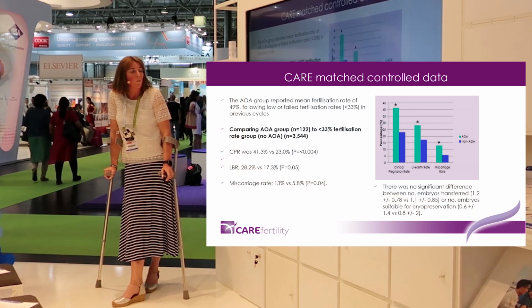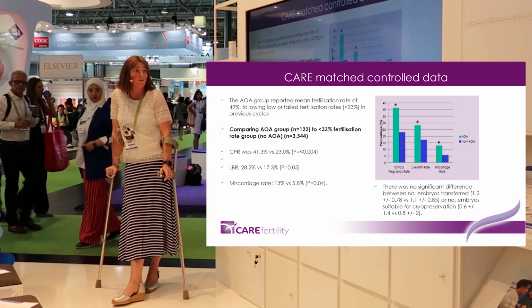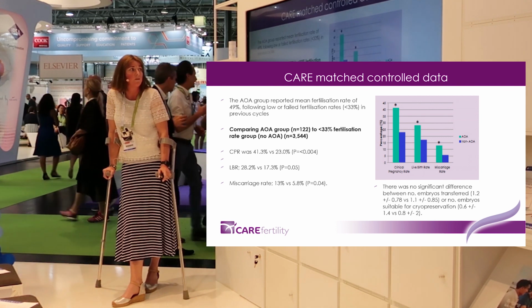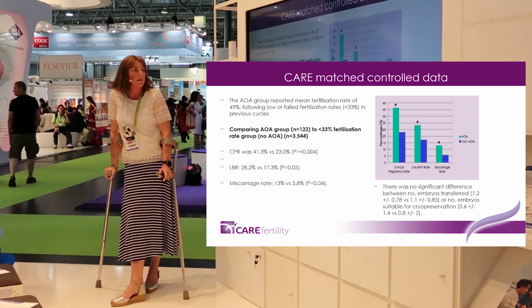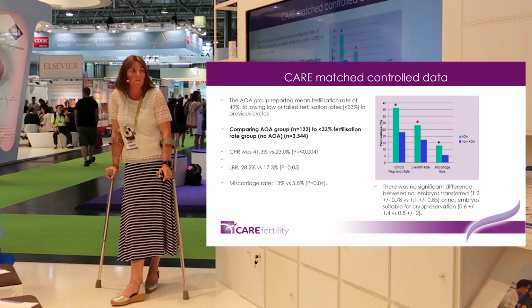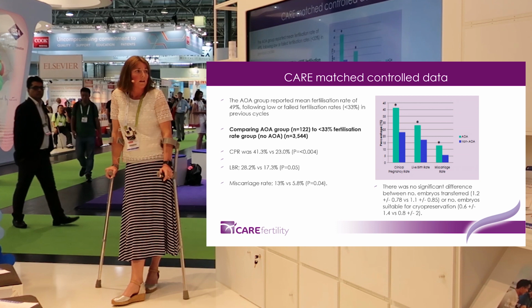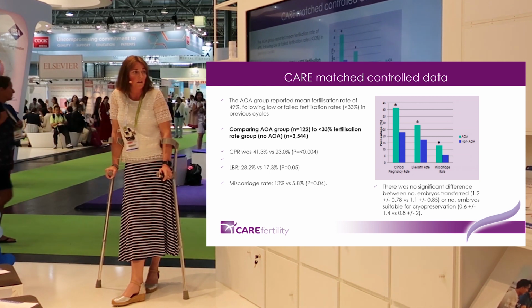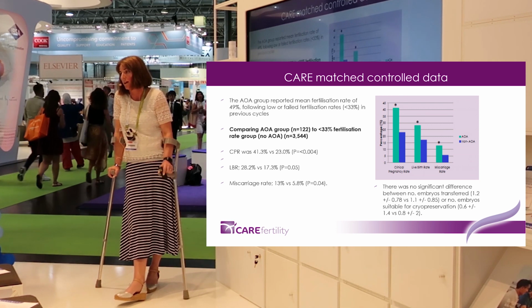So we offered it to patients, and we found in that group of patients that have used it, the mean fertilisation rate has increased to 49% for these patients. And then we compared it to patients who didn't use it and also had a low fertilisation rate of less than 33%, and found that all the clinical outcomes were significantly increased by offering it.